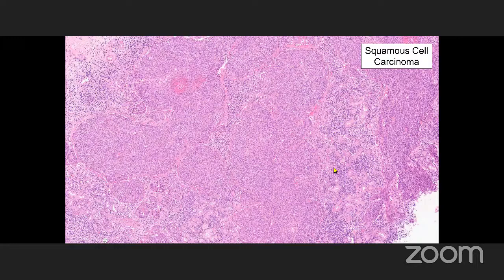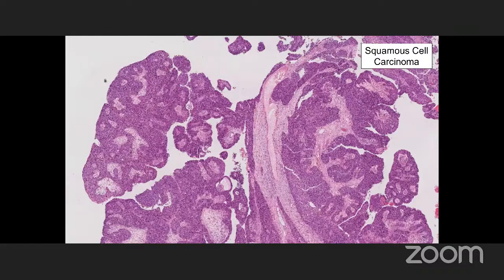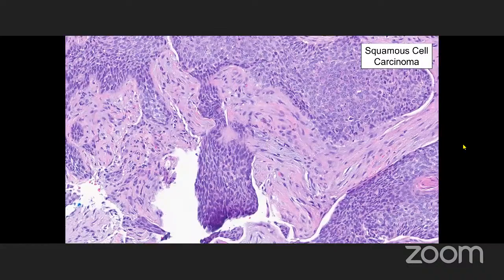They don't tend to have a lot of desmoplastic stroma, so they really channel oropharyngeal squamous cell carcinoma in that way. They often have surface growth, so they have this kind of almost papillary ribbony surface growth, and even the invasive stuff will be kind of pushing or ribbony. And here's another example that's very, very exophytic and a lot of superficial surface growth with papillary growth. And non-keratinizing squamous cell will give you this clefting a little bit sometimes. And here you can see a little bit of squamous differentiation.